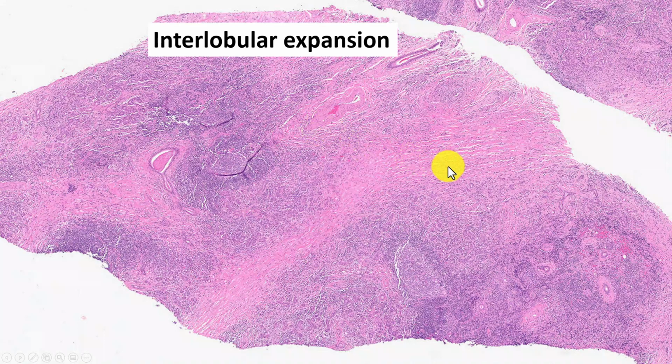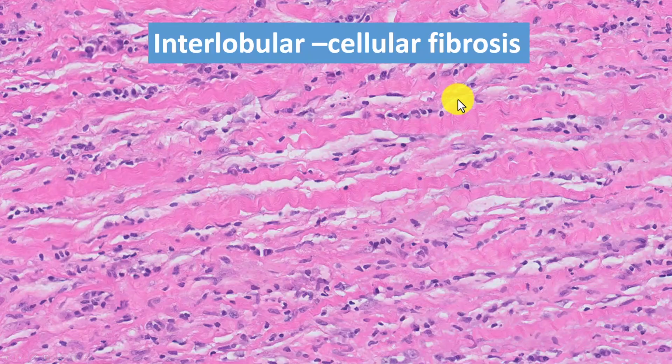There are several things in this image that are very telling for IgG4-related disease. Yes, the lobular pattern, but also notice the interlobular expansion and the massive inflammation. These are so deeply inflamed that you would consider a lymphoma. There are a couple of other things. Notice there are ducts here, but there's no ductal damage and no periductal inflammation. In fact, the inflammation tends to stay away from the ducts. And finally, there's something going on here that we'll talk about in a minute.